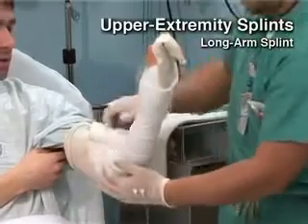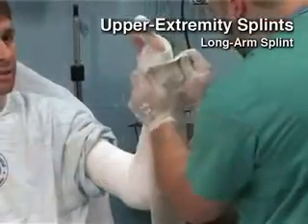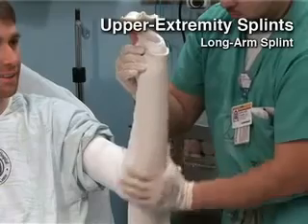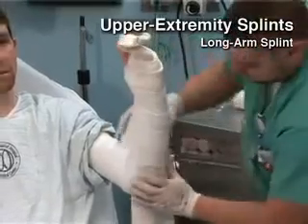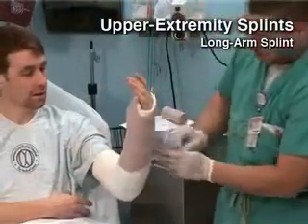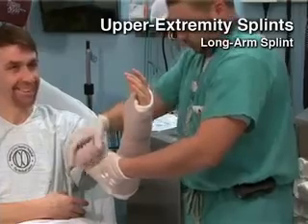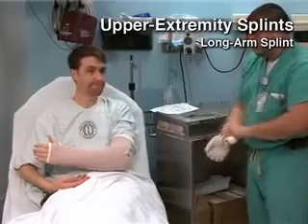A long arm splint will immobilize proximal forearm and elbow fractures. It can also provide temporary stabilization of intra-articular fractures of the distal humerus and olecranon while awaiting surgical care. When splinting a joint at an angle, be sure to wrap the extremity in the expected final position. Avoid excessive padding around the anterior aspect of the elbow joint in long arm splints, as this can result in skin pressure points and swelling under the splint. This splint prevents flexion and extension of the elbow and limits supination and pronation of the forearm. It extends along the posterior arm from the wrist to the proximal humerus; place the elbow in 90 degrees of flexion while maintaining a neutral position for the forearm and wrist.